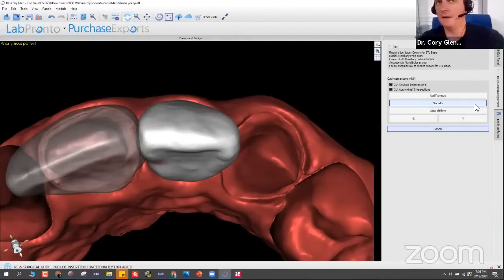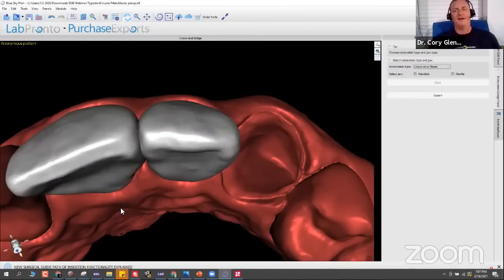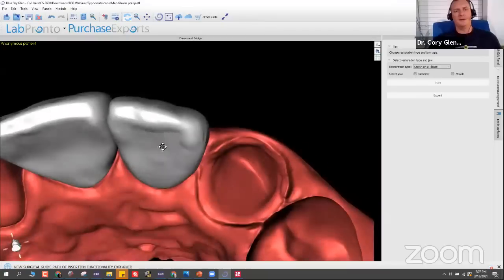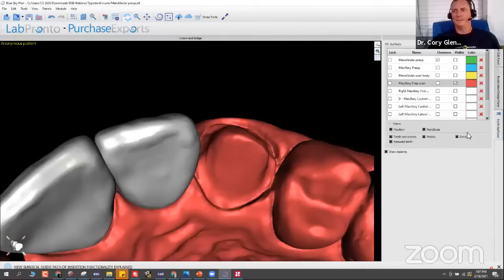I'm not sure about the Vita base aspect. The shades, they've usually got all of the A shades and then a bleach and a B1 and usually an isolated C color. I don't know what they are specifically off the top of my head. Since most of what I deal with is full arch type stuff, pretty much everybody's getting A1. That's just for simplicity what I've done. But again, I know you could get online and see exactly what shades are offered. And maybe at the end, if we have time, we could pull up their website and look at that.